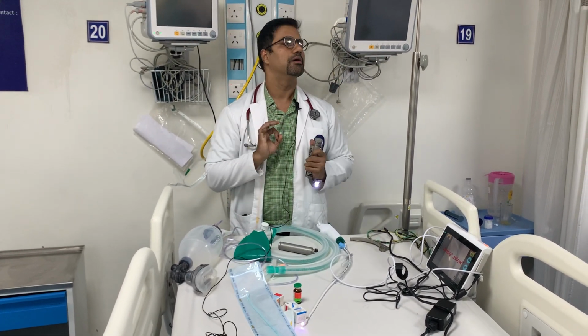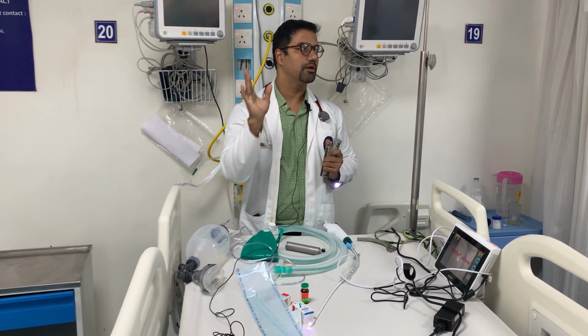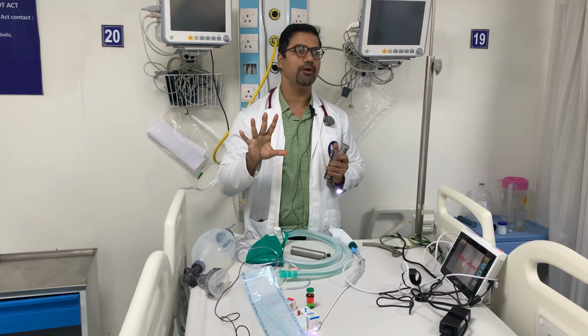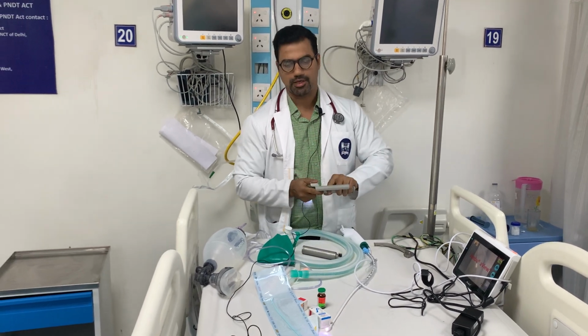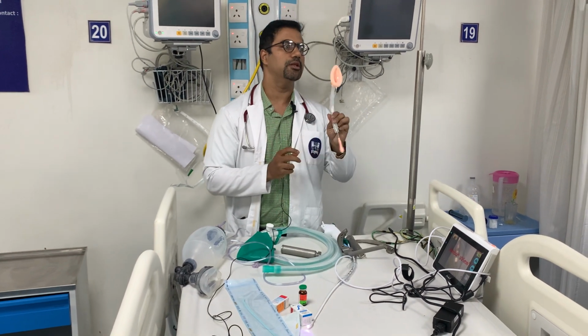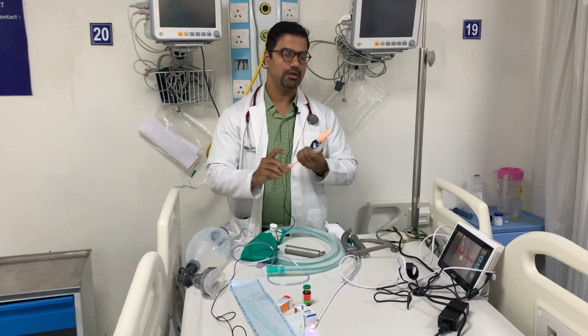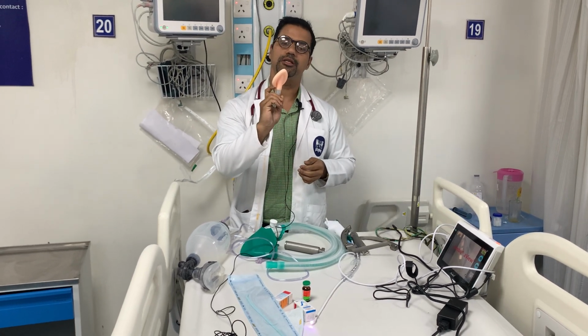Okay. Even this is a failure. 5 attempts, all failures. By the time you have to call someone for help, okay, if someone is coming well and good, then this can be a lifesaver. This is called the laryngeal mask airway. Okay, you are not able to intubate the patient. Use this laryngeal mask airway.